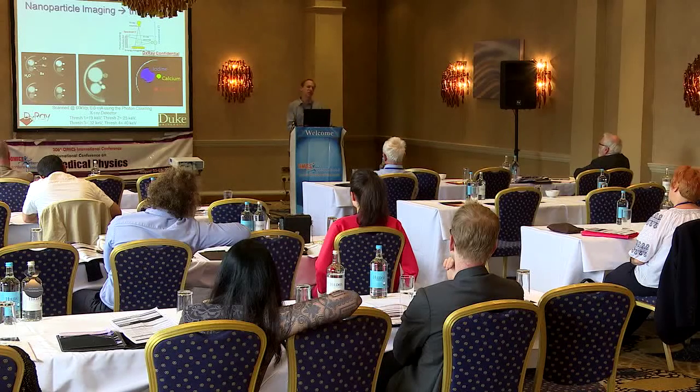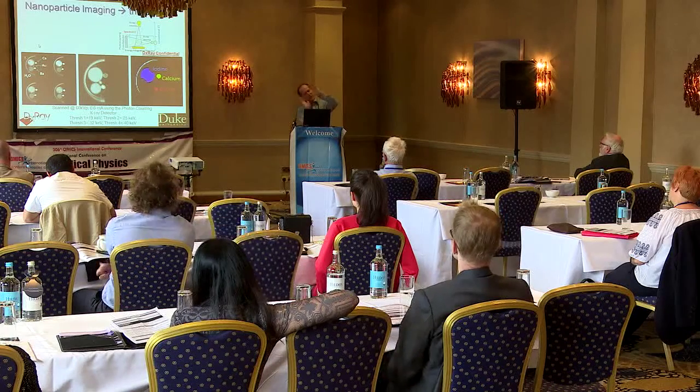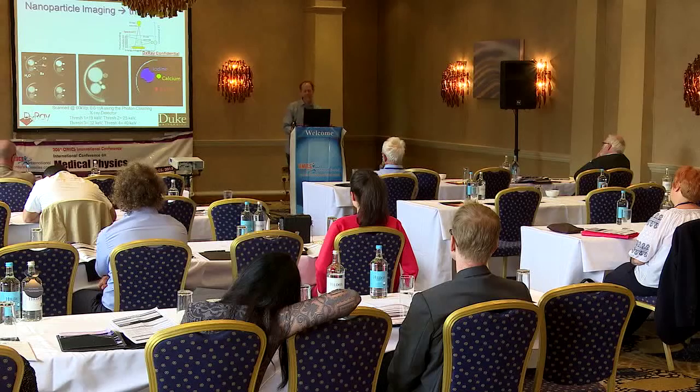So here you can see some Phantom. Phantom was made with millimolar concentrations of nanoparticles in cylinders inside a cylindrical Phantom, including gold, bismuth, iodine, and calcium carbonate.